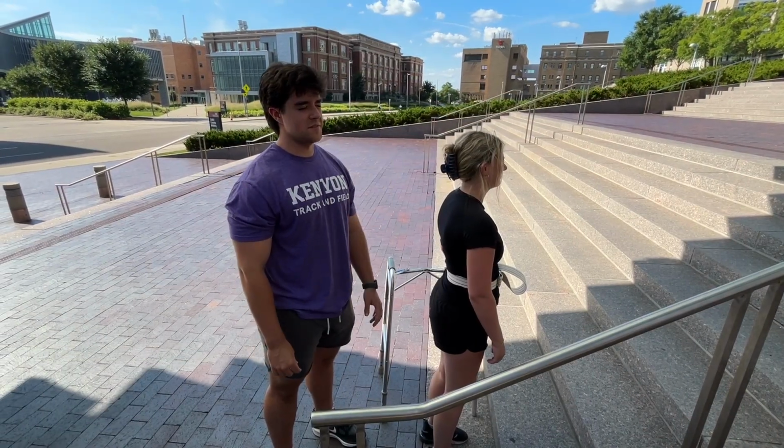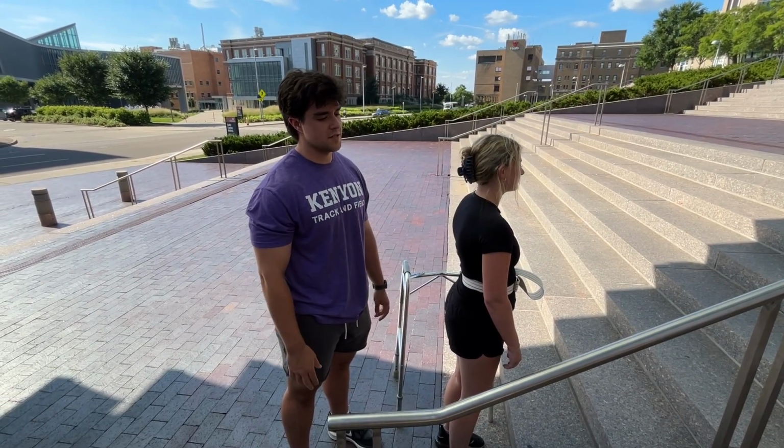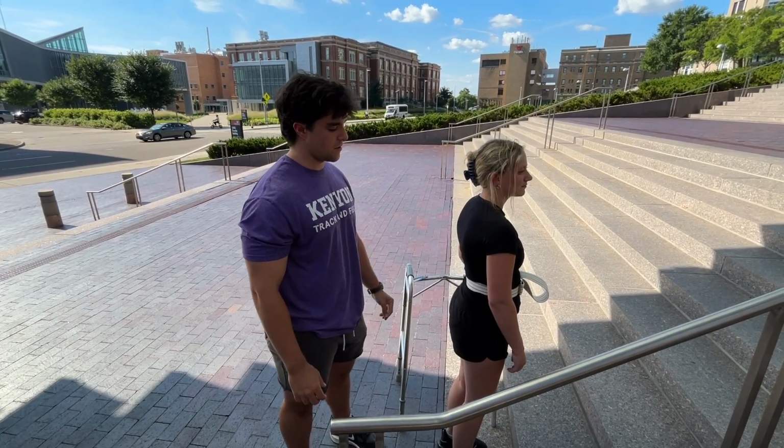Hi, I'm Riley. I'm a student physical therapist. I already washed my hands and introduced myself professionally to my patient. So today we are going to be going up the stairs with a walker.